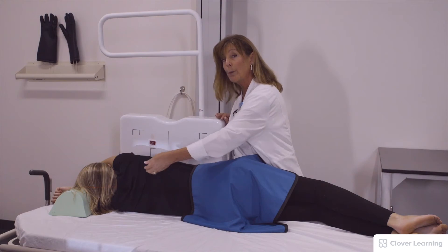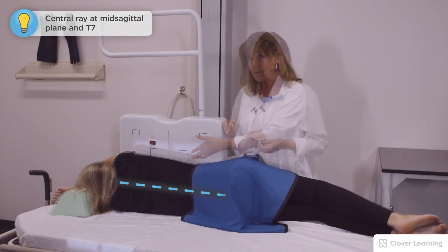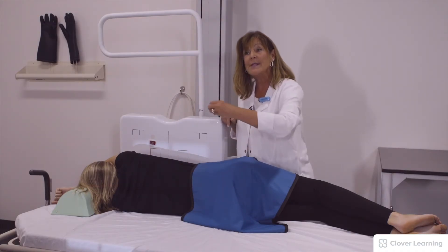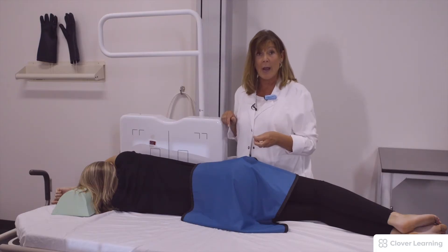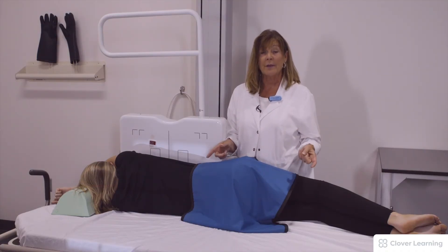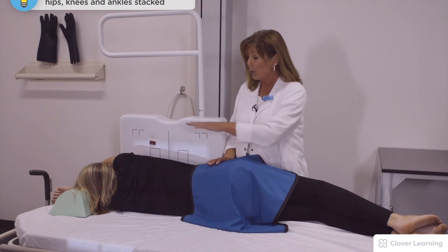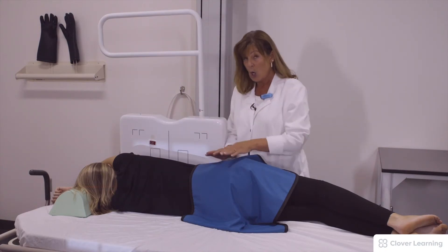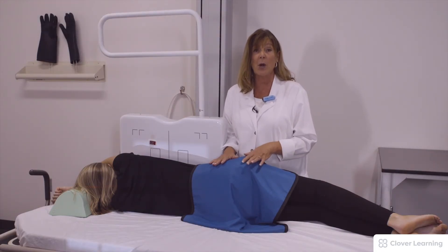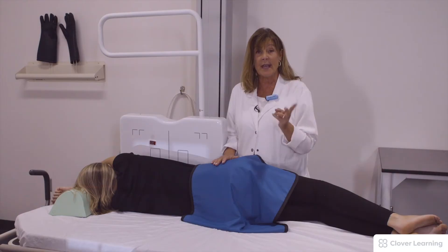The x-ray will come in from her posterior side and exit the anterior side, so the projection is PA. We want to use the mid sagittal plane, and we are using T7 as our central ray. The tube is set at 72 inches with no angle. I have a right marker indicating the right side. I have shielded the patient and made sure the stretcher locks are locked. The patient should be in true lateral — shoulders stacked, arms overhead, hips, knees, and ankles all stacked. We want her to lie in this position five minutes prior to taking the exposure so that the air will rise and the fluid will fall. We will take this on second inspiration.